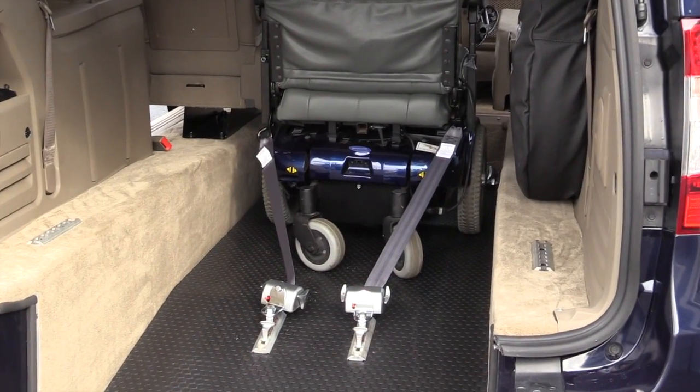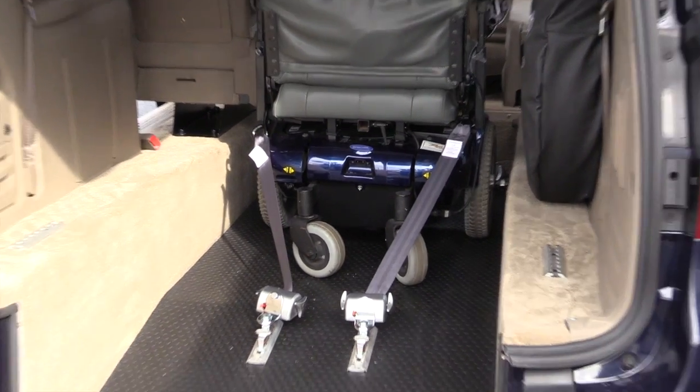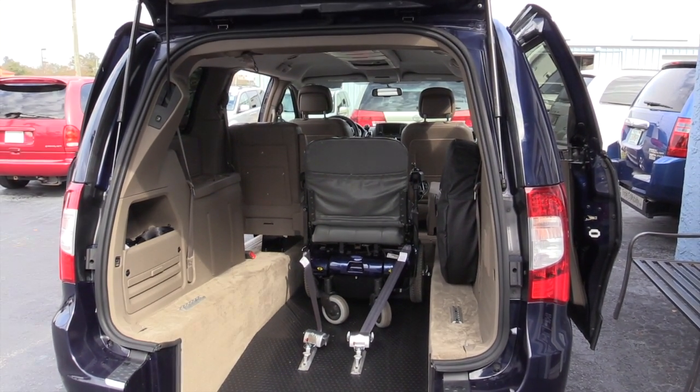Now your wheelchair is secured in the rear with two retractable tie downs, so you can move to the front to secure the two in the front.